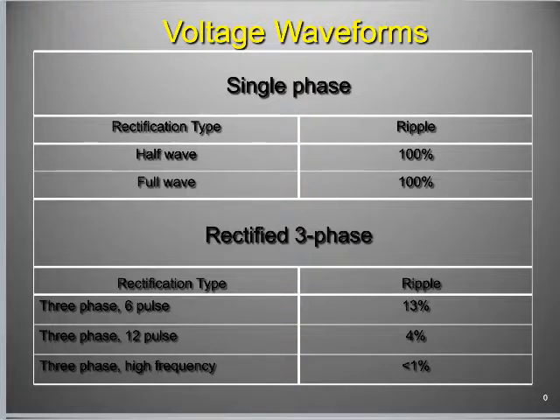We've got generator on one side, spinning the magnet, inducing an AC current in the wire. And on the other side, it looks very similar, but that's a motor. The coil, the power's passing down the wire and it's spinning the magnet, right? So on one side inducing power, on the other side spinning the magnet. That's what that illustration is there for.